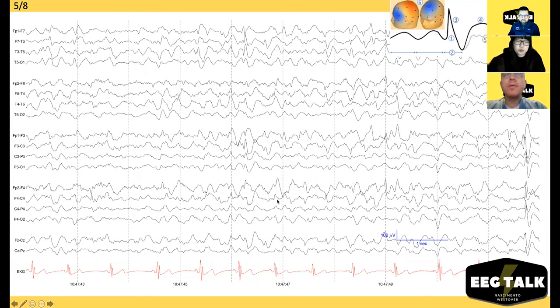Six out of eight. Yes to spikiness — one point. Different from ongoing wave duration — two points. Asymmetric? I think it's symmetric. Slow wave — yes, three points. Disrupt background — yes. And field — five points. It is a spike.